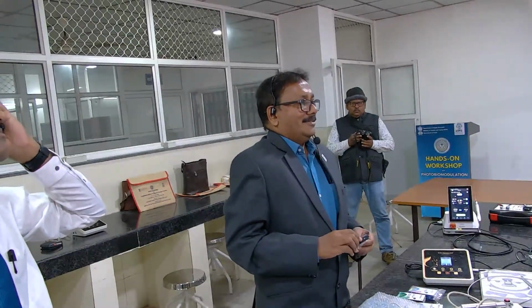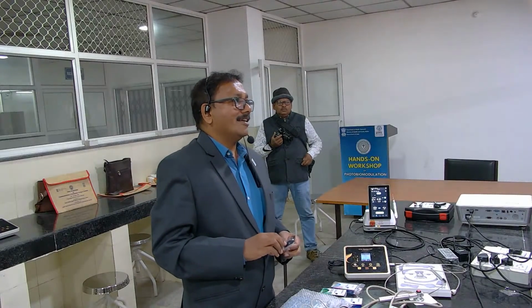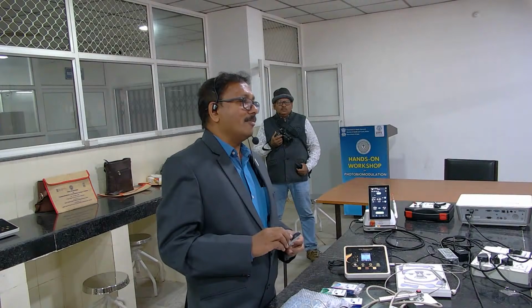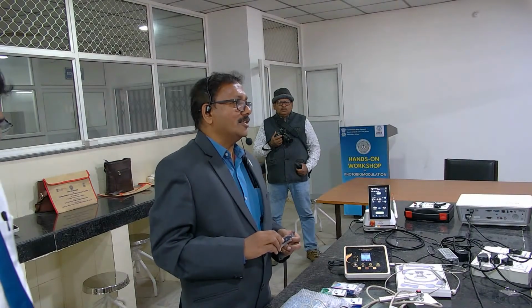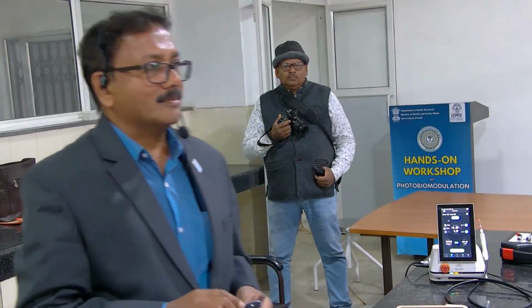In patients undergoing radiotherapy, can we use lasers to treat the complications such as oral mucositis and all? Definitely. That's what I say. The American Academy of Oncology has made it mandatory for each and every patient to compulsorily go for a photobiomodulation for prevention of oral mucositis before irradiation for those cancer patients. Okay, sir. Thank you.